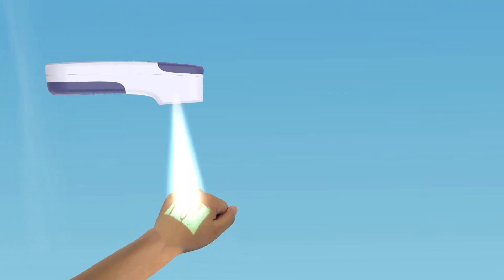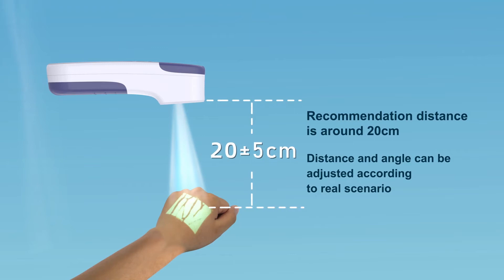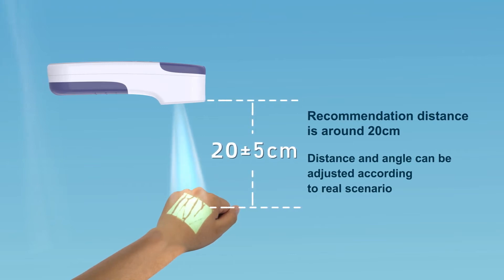In order to get a good vein image of the patient, keep the distance between VeinFinder and the skin at around 20 cm. This distance can be adjusted appropriately according to the real scenario, and the projected image will appear clear.